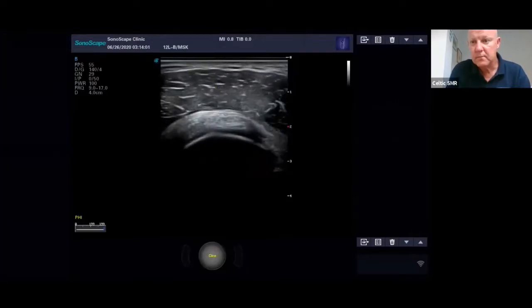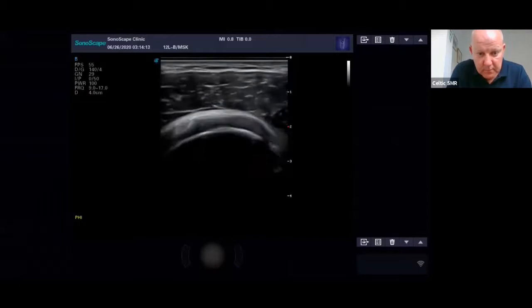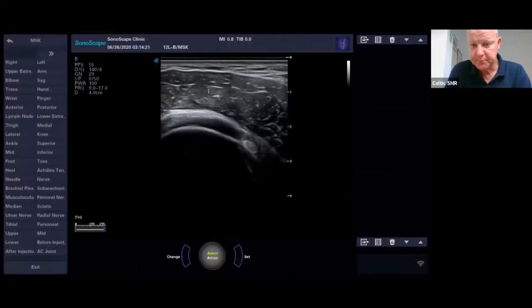If I freeze that, then I'm just going to quickly annotate this. So this will be the deltoid. This is the supraspinatus. Now, I'm a little bit off here, so let me just go back. There's the biceps tendon. So deltoid. Just let me know, Abid, if you're struggling with that position. Thank you. Supraspinatus there. This is your humeral head, and this here is your biceps tendon. So this is your landmark picture first of all.